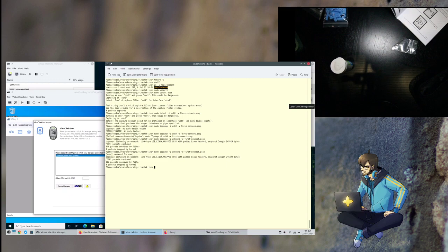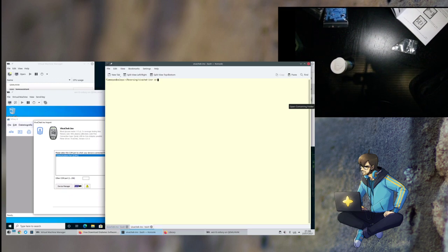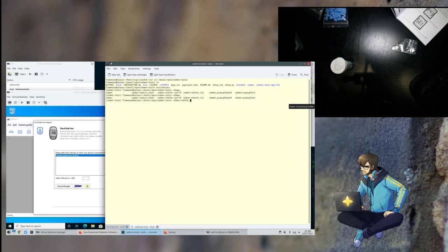Now let's try to take a look. Dev repos, USB mon tools, activate venv, and then I'm going to use USB mon chatter. Do I have a chatter? No, I don't have any chatter for that. USB mon chatter. I cannot do HID because it's not HID. Now let's open Wireshark then. Wireshark. Reversing Viva check. First one.